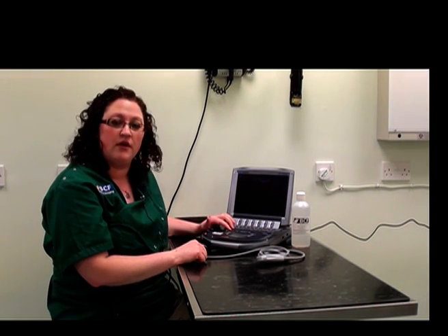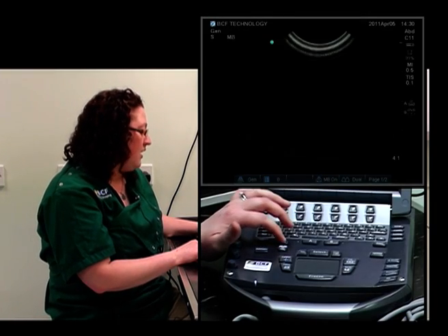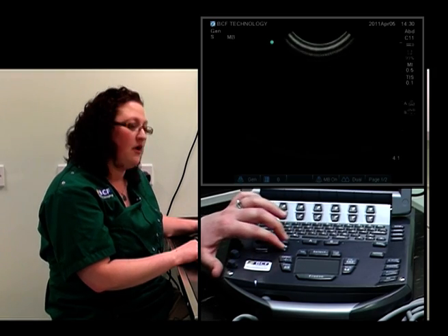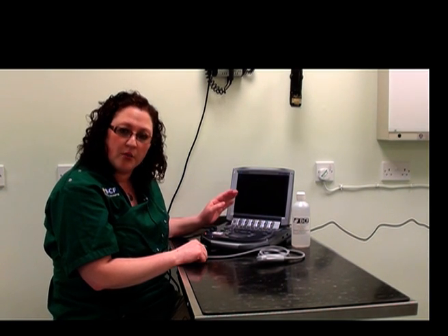Some other buttons that will be helpful to know where they're located are the depth button. On this machine, it's located right in the center and we can decrease or increase the depth. It's important to know where this is because it will change throughout the ultrasound examination itself. It's usually a good idea to have the organ of interest occupying about three quarters of the screen on the monitor at any one time.